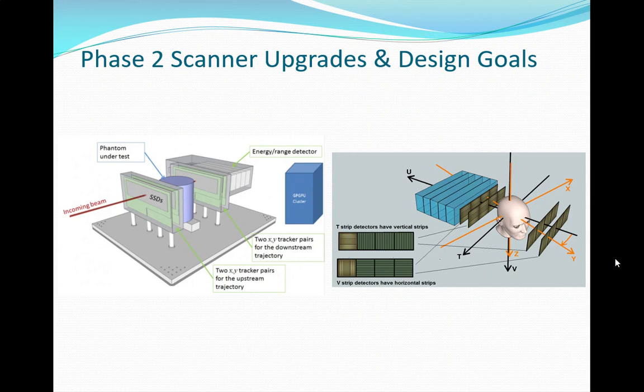What it does is it hits typically something like cesium iodide. This is used also in X-rays and other things. Cesium iodide is one of those things that interacts well. Iodine's really heavy. If you remember, it's one of our big tracer ones. It interacts with things nicely, right? Not only is it big, but since it's got a bunch of transitions in the visible range, you get a lot of light when it gets perturbed by one of these radiations passing, whether it's a photon or a particle. So we call it a scintillator, right?